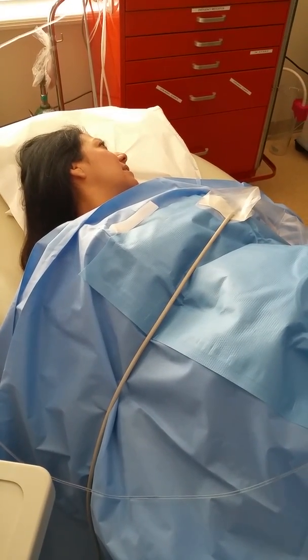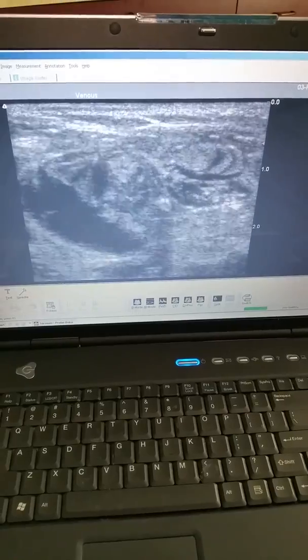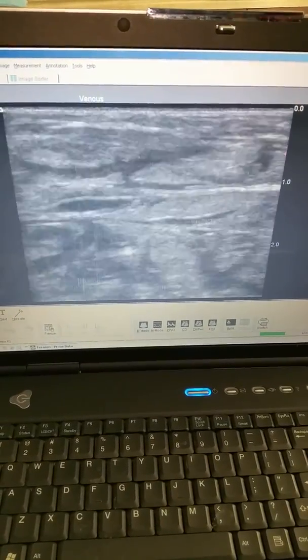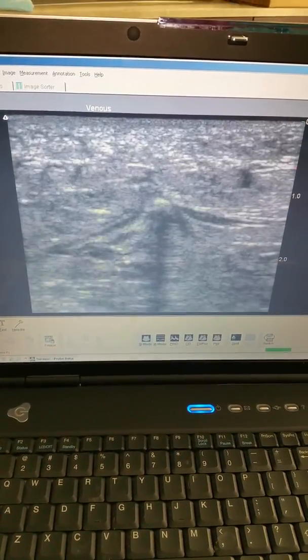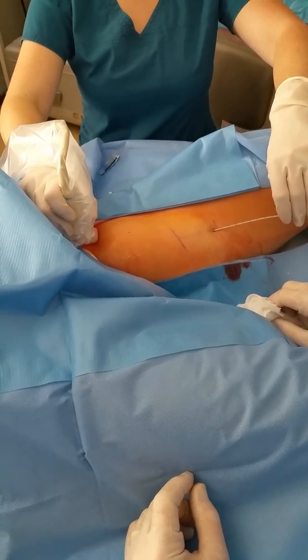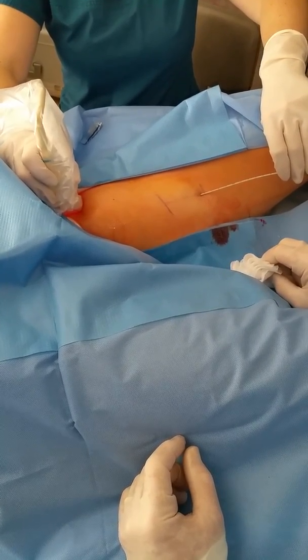Carmen, how are we doing? Is this hurting you at all? No. So we're done with the tumescence. We have a nice sheath around the entire vein wall, and there's the access point right there. We're right at the junction, so I'll pull it back about two centimeters distally.